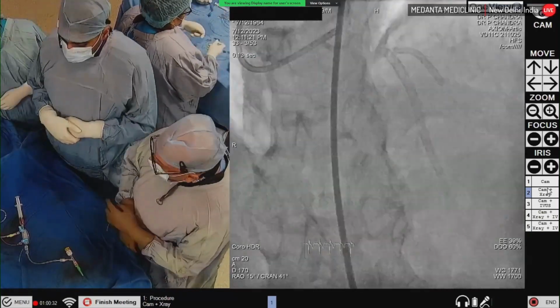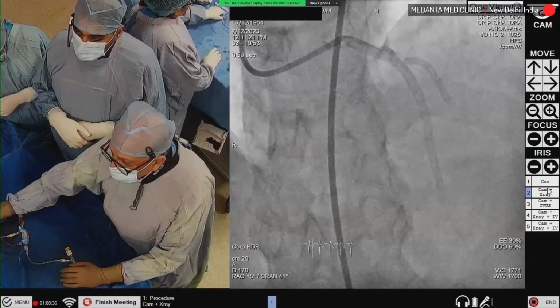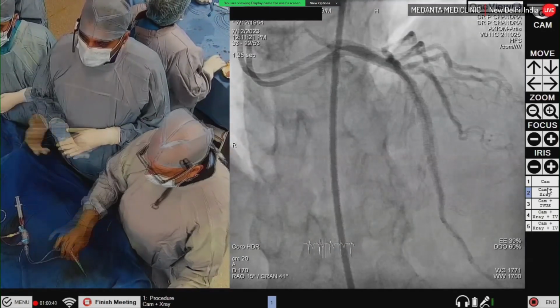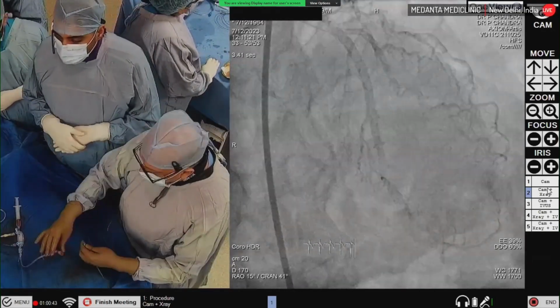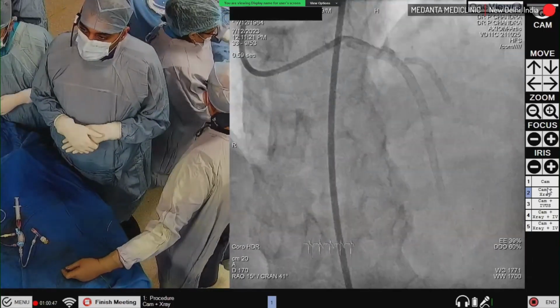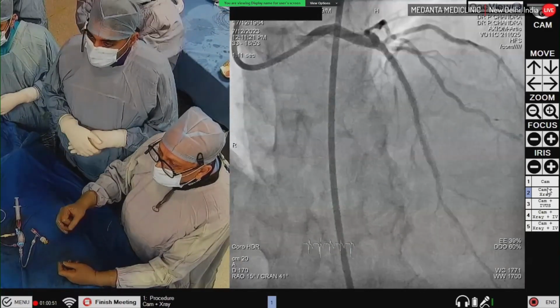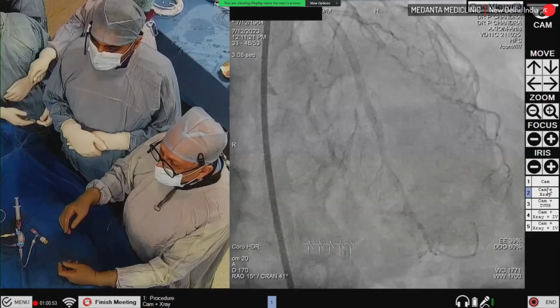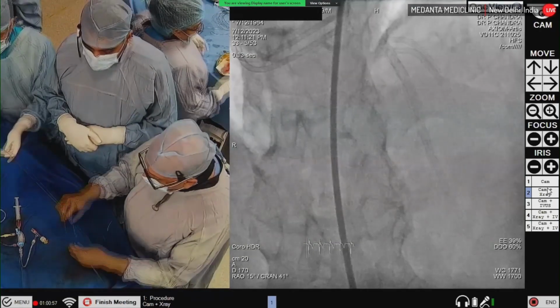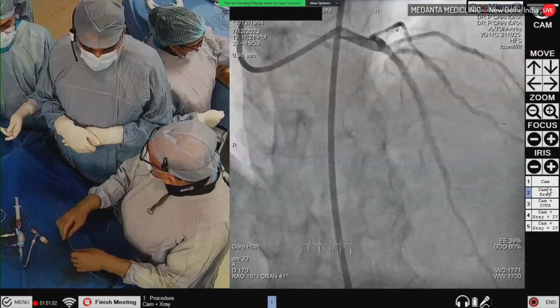Okay. So you want to say something? Yes. So again, these small vessels are being treated and are showing a very good result. Dr. Chandra has done more than 500 cases in such vessels, and you can see the results in 2013 as well. Dr. Chandra himself can appreciate how wonderfully it is flowing. So I'm quite happy that everything is okay. Another 20 years, the patient can do very well now. Dr. Singhal?